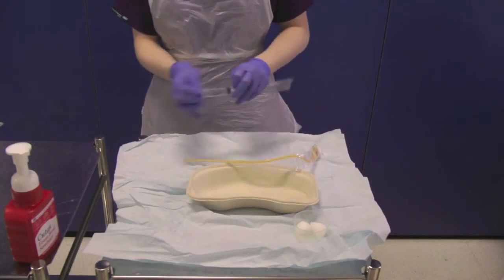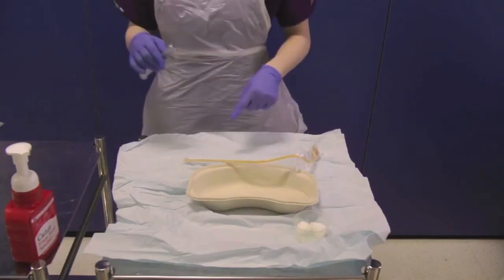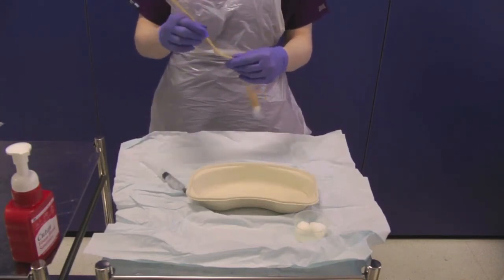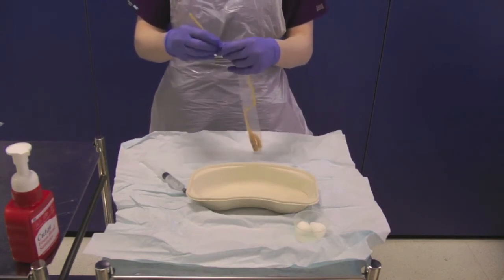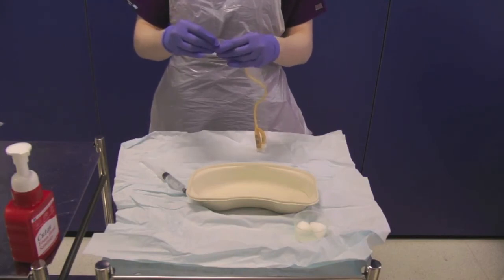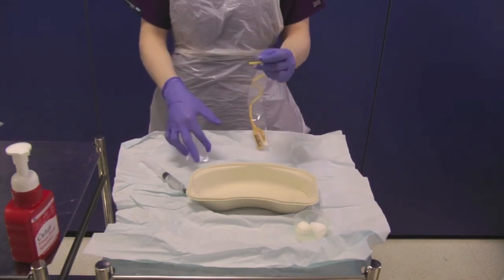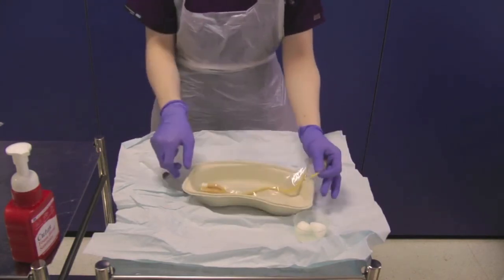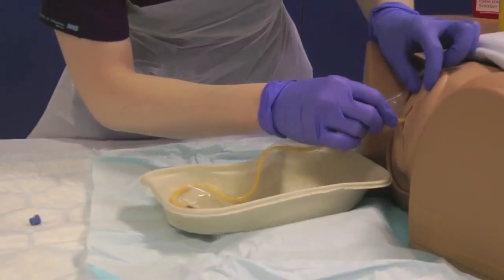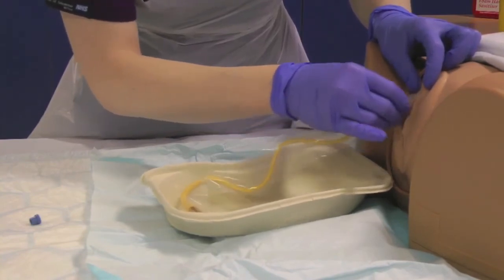Open the 10 ml syringe from its sterile packaging and leave this on your sterile field. Open the urinary catheter from its sterile packaging using the perforations to help you, exposing the catheter tip only. Hold this in the sterile J tray and place onto the bed between the patient's legs. Avoid touching the catheter directly using the packaging as a barrier.